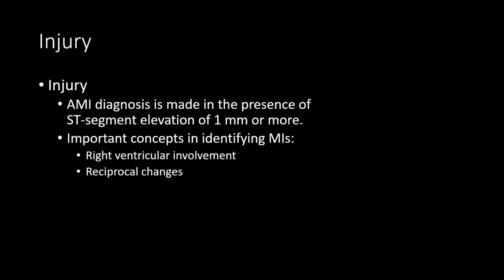An AMI diagnosis is made in the presence of ST elevation of 1 millimeter or more. There's also a couple of other important concepts when identifying MIs: right ventricular involvement and also reciprocal changes. Reciprocal ST segment changes are defined as ST segment depression in leads separate and distinct from leads that reflect ST segment elevation.